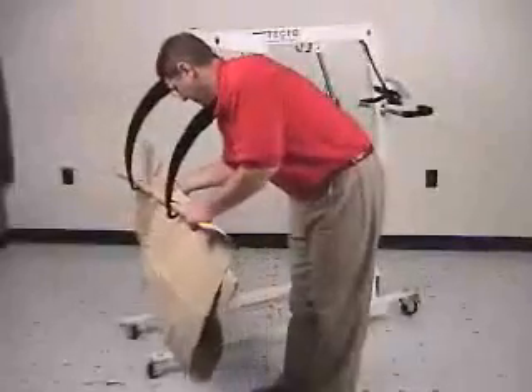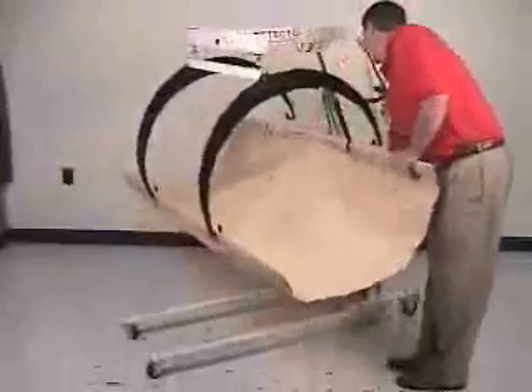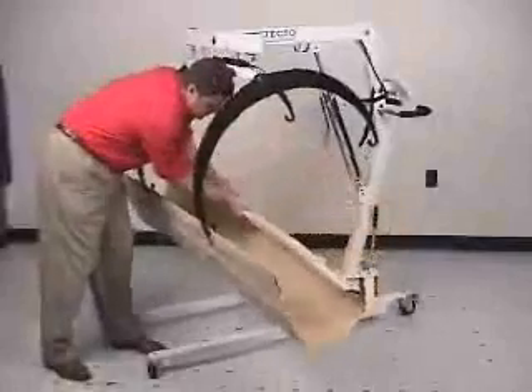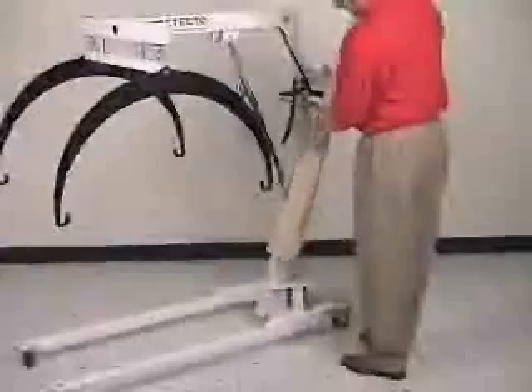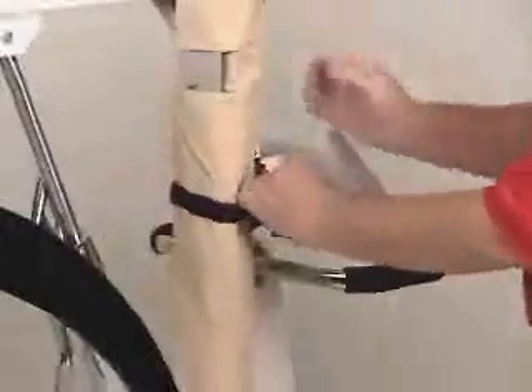Fold the long ends of the stretcher together to facilitate carrying. As demonstrated here, attach the stretcher to the hoops to ensure the assembly has been done correctly. Remove the same way with the long ends together, roll up the stretcher, and place it in the specially designed cup at the bottom of the scale for transport. Secure the stretcher with the velcro straps provided.